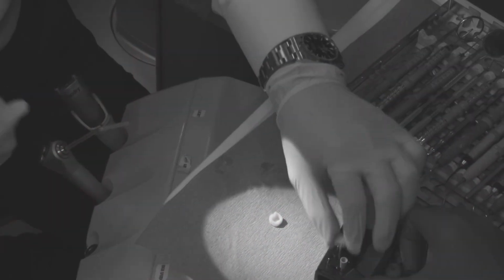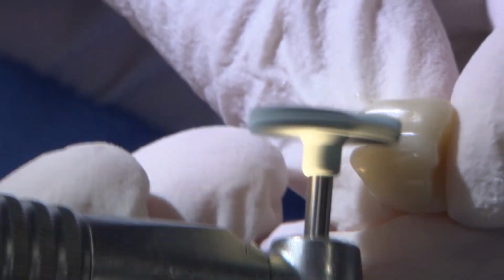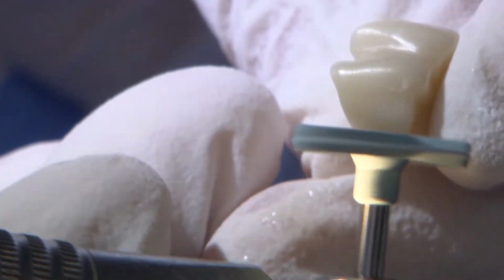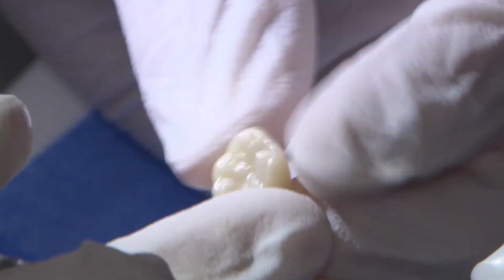And I'm going to switch now to the high polish. So the diamond particle size on the high polish is just smaller. And that is what enables this greater contact and really getting a high shine. But again, with BruxZir, I typically don't go after it too much. I don't get it too shiny because it comes out pretty nice already.